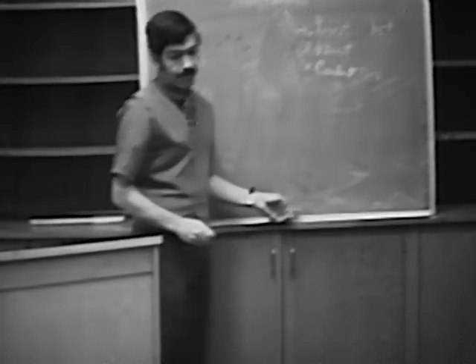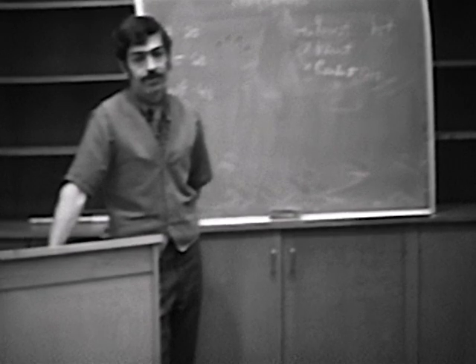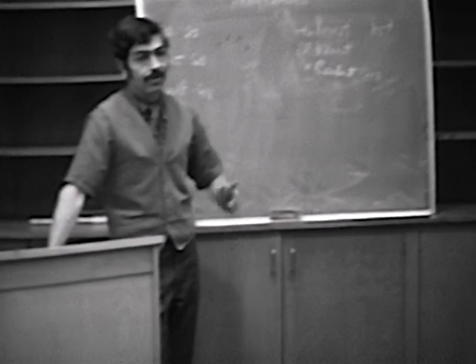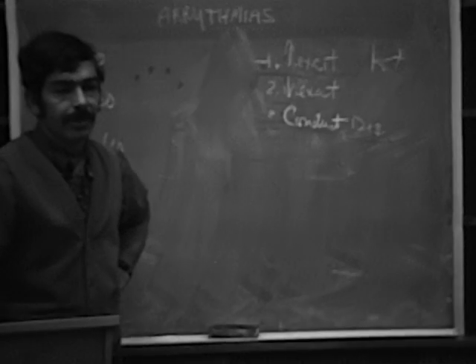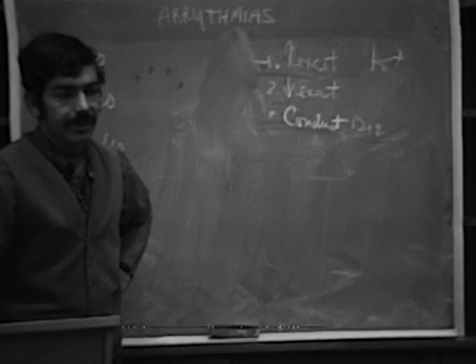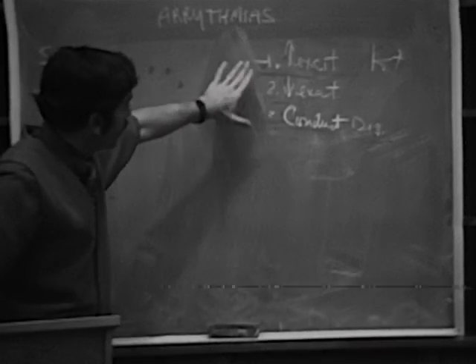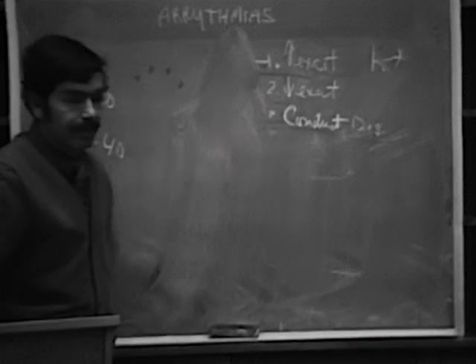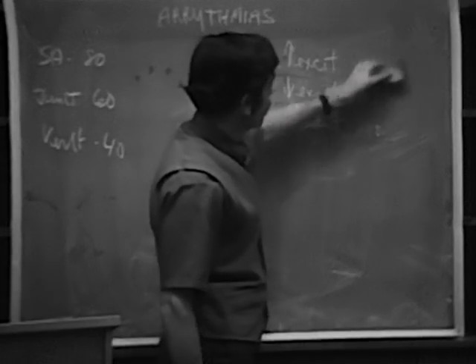you can also understand the difference between complete heart block and AV dissociation. This is something that I know always confuses a lot of people. They use the terms interchangeably, and they're really not the same thing. Sometimes it can be a little difficult to distinguish the two, but basically, from a theoretical standpoint, there should be no difficulty in distinguishing the two, right?